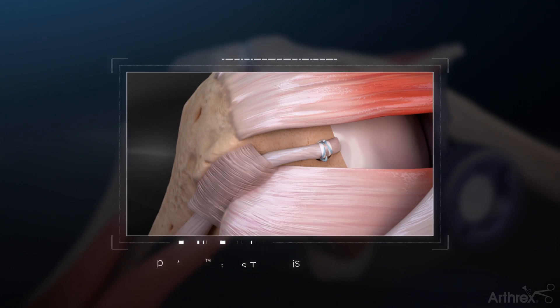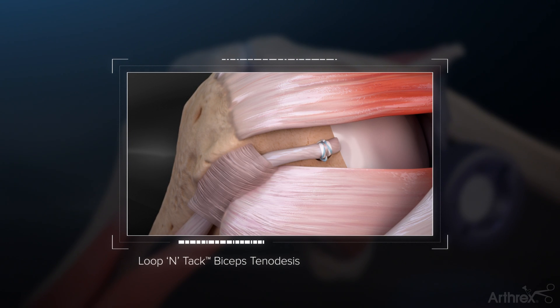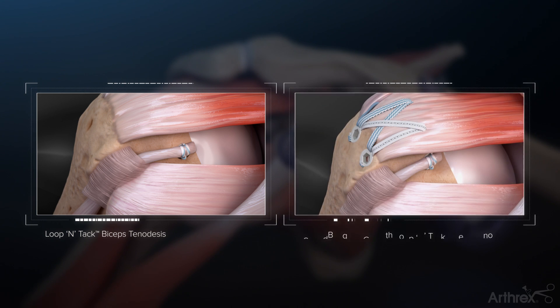The Loop 'N' Tack biceps tenodesis technique allows for an arthroscopic knotless repair at the top of the bicipital groove, eliminating the need to externalize the tendon for preparation. This repair can be incorporated with a medial row anchor in a knotless rotator cuff repair.